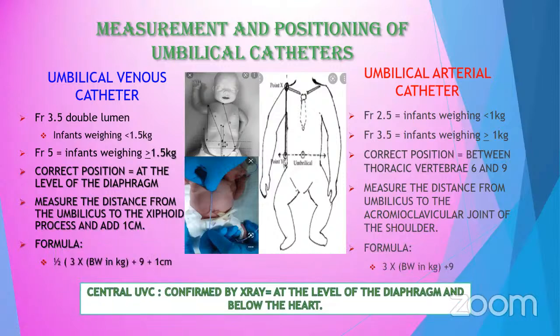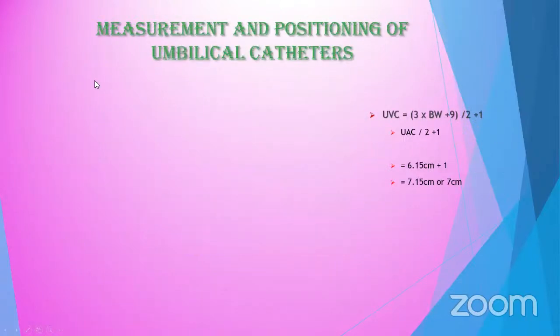So central UVC should be confirmed. The diagnostic test is via X-ray. It should be at the level of the diaphragm and below the heart.